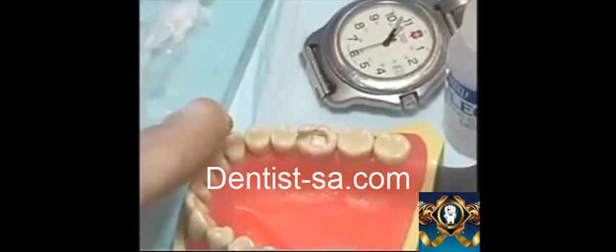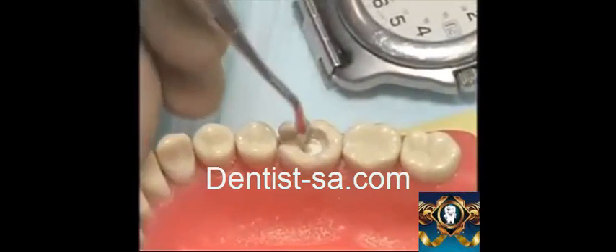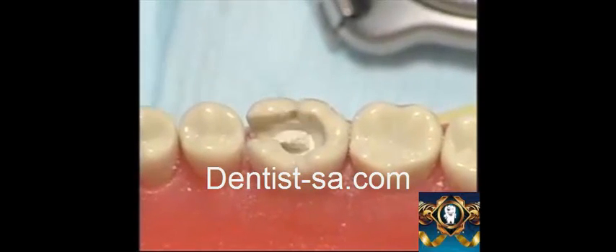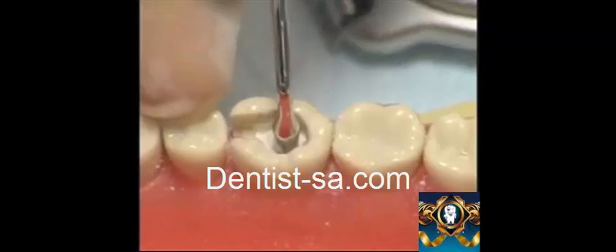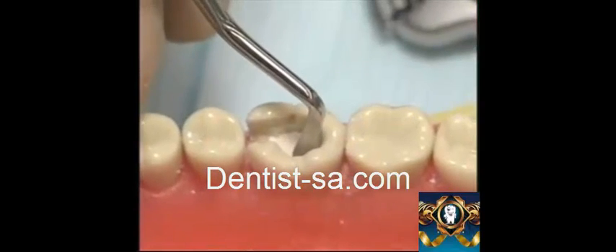Roll the zinc phosphate cement and divide it into pieces. With the condenser, pick up a piece as big as the area where it is going to be placed, and place the piece into the cavity. Pack the piece down into the cavity preparation using the condenser. Now pick up a smaller portion with the condenser and pack it until you achieve a one millimeter thickness. Take special care not to contaminate the wall of the cavity. If there is any excess cement, carefully remove it using a spoon excavator.